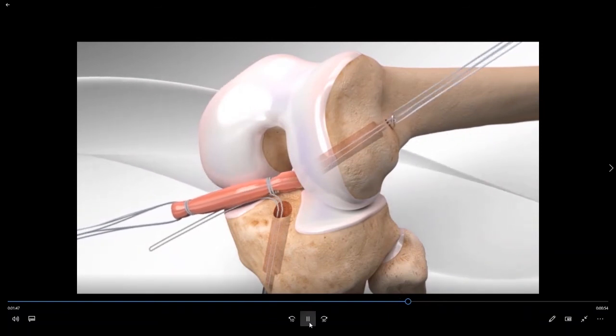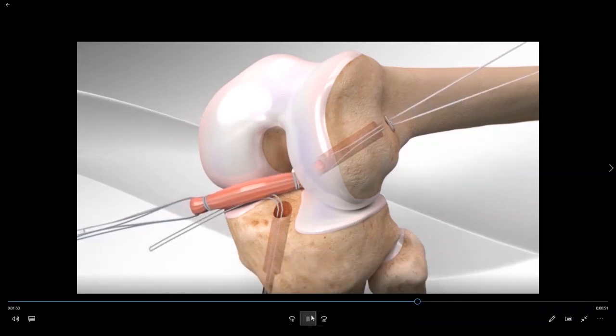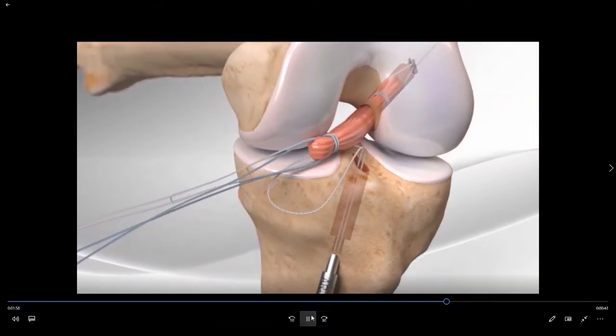We now have the hamstring tendon graft. We have pulled the leading femoral sutures and the femoral cortical button up through the 3.5 millimeter hole, and the button flips and gets caught on the outside of the bone. We then tension the device from the outside, which decreases the length of the loop, pulling the new ACL up into the femoral socket. This is very precise and allows us to achieve adequate depth of penetration of the graft into the bone.